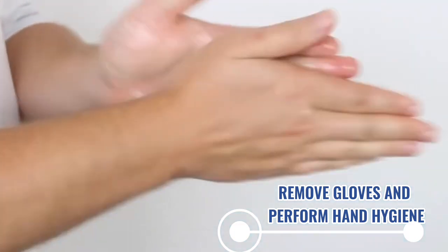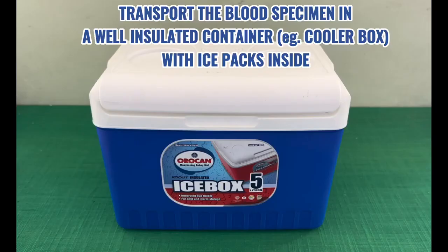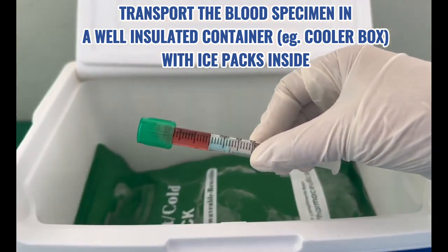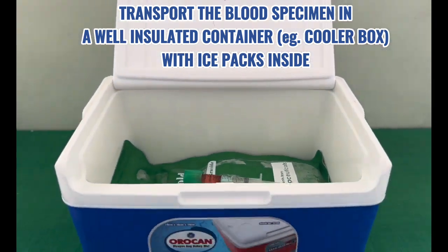Remove gloves and perform hand hygiene. Place the blood sample in a well-insulated container with ice packs and transport safely without delays.